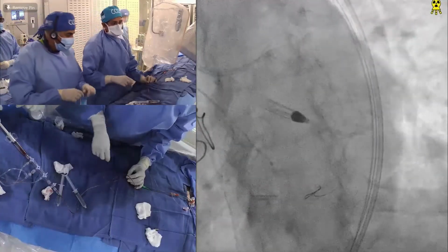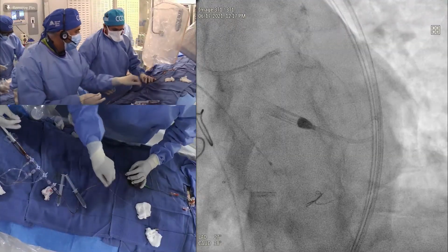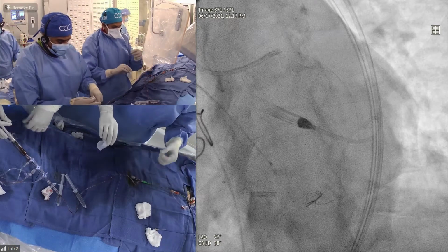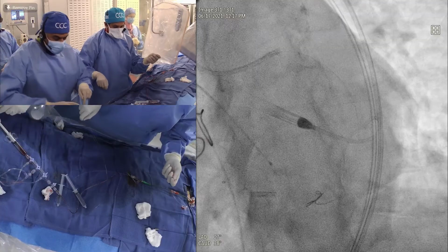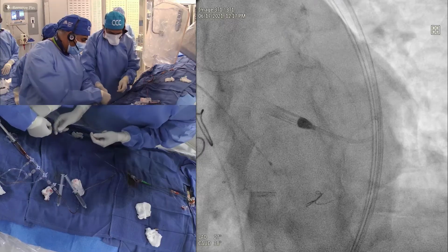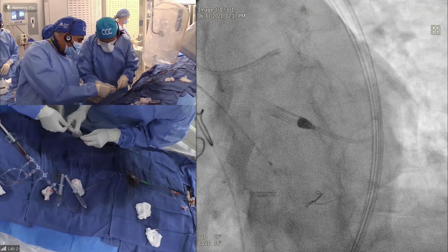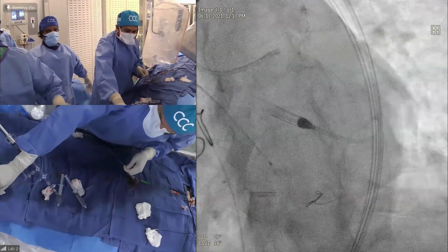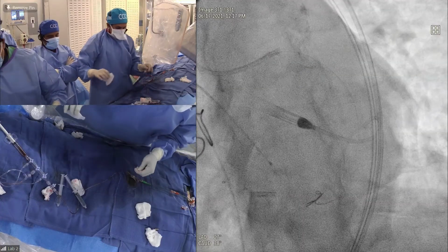Now give me... Yeah. So the key is, of course not in those significant lesions, but also I think the role of imaging, we find so much more when we do imaging. Everybody has their practice and everyone is very respectful of the great results you all have, but we wanted to make sure we mention the role of imaging in guiding intervention. And we will do that, I'm sure, when FFR, IFR is indicated.